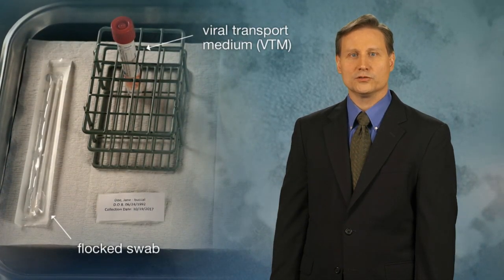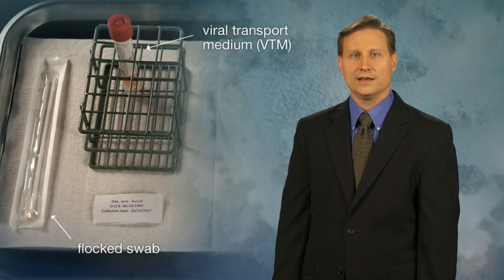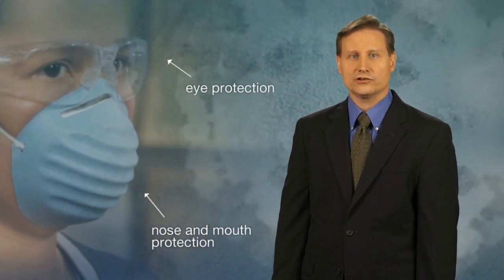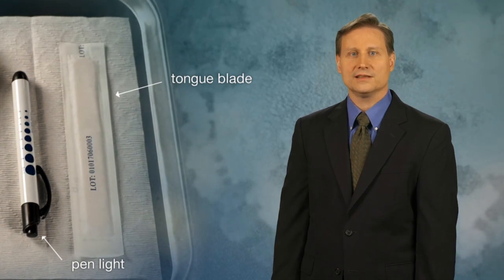The supplies needed to collect a buccal swab include a flocked swab, preferably synthetic, and a tube of viral transport medium, or VTM, and eye, nose, and mouth protection. A tongue blade and pen light may be used to locate the Stenson's duct.